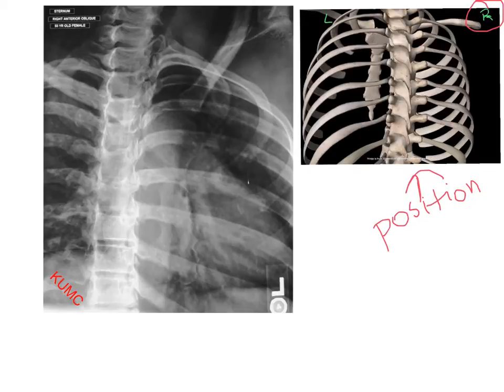By positioning our patient in an RAO position, it shifts the sternum just to the left of the thoracic vertebrae, and it throws it into our nice homogeneous heart shadow, and it gives us some contrast so that we are able to see it better and have it thrown forward on the RAO projection that you see to your left.